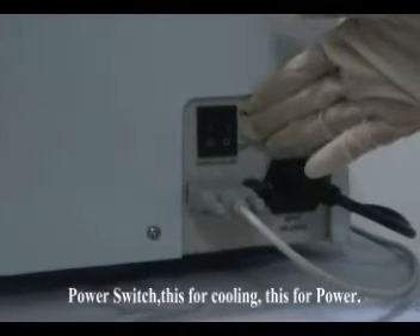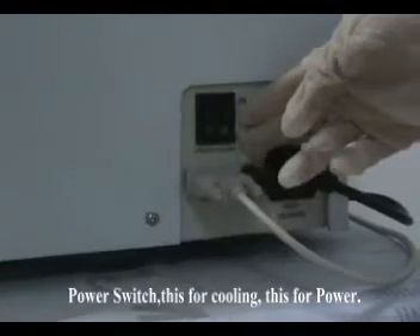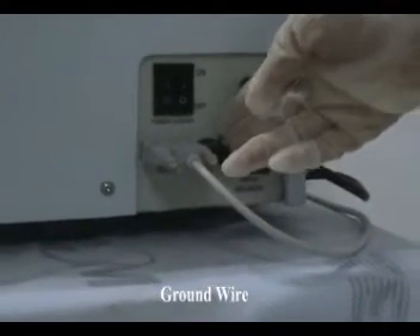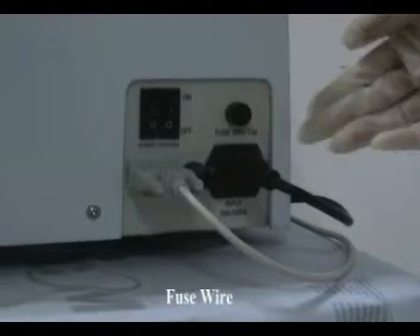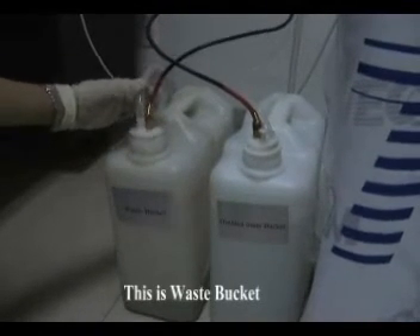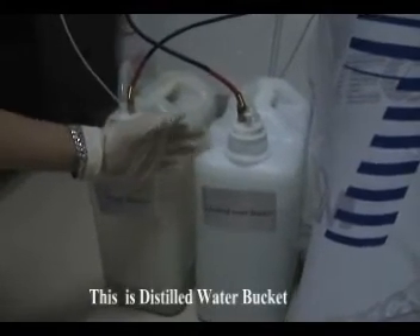Power switch — this is for cooling, this is for power. Communication port, ground wire, power line, fuse wire. This is the waste bucket. This is the distilled water bucket.